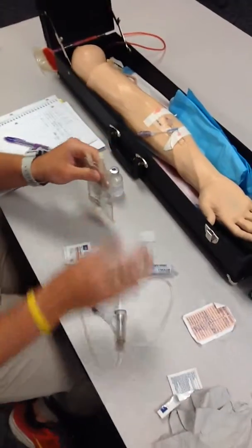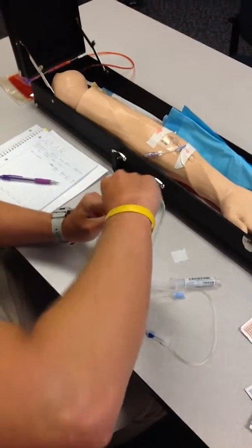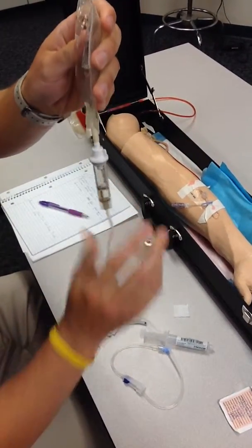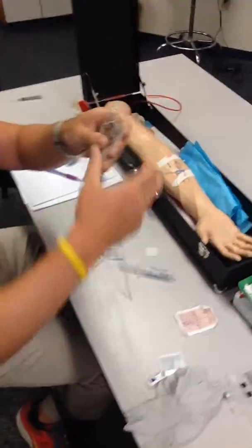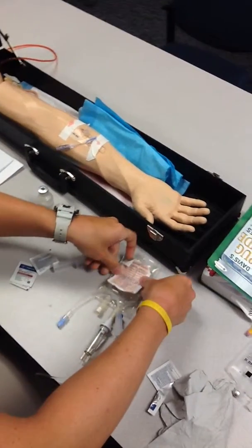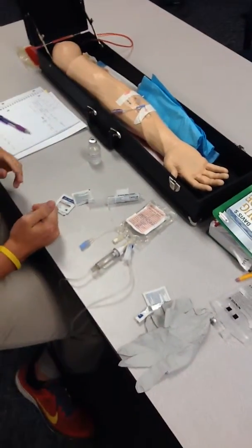Alright, so next I will take my tubing and I will prime this bag. I will remove the cap and insert. I'll make sure some comes into the drip chamber so we can get some drops going to prime. We will loosen the connection. So we have drippage, therefore the tubing has been primed. At this point I will add a label to the Minibag to verify the patient, the dosage, the amount, and the time and date at which we're going to start this Minibag.